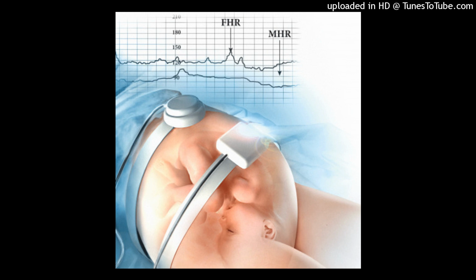Accelerations. Accelerations are defined as visually apparent, abrupt increases in the FHR and may be periodic or non-periodic. The peak of the acceleration must be at least 15 bpm above the baseline, lasting at least 15 seconds or more from the onset to return, figure 14.10. The onset to peak occurs in less than 30 seconds.